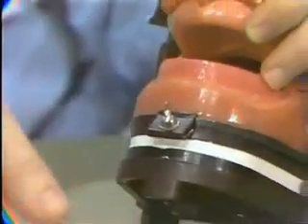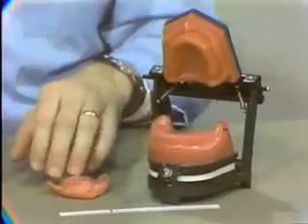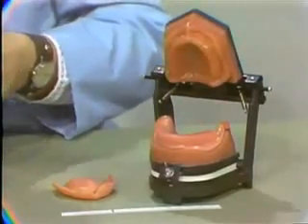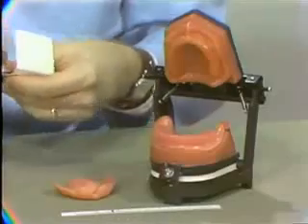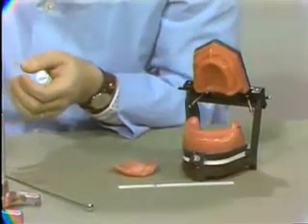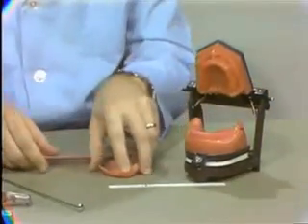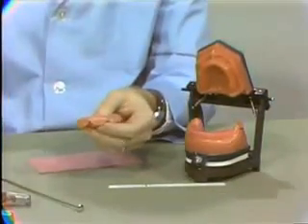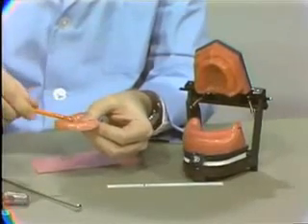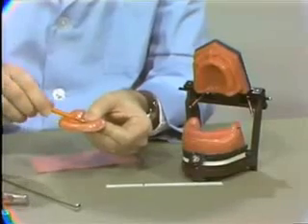Okay, let's demonstrate that now. This is exactly what you will be doing in a few moments in the laboratory. Now, as mentioned before, you can use either hot water or you can use a flame to soften the wax. I'm going to use flame. And for this size of a master cast, I suggest that all you need is about 2/3 of a sheet of wax. If you use a sheet, or some of you are using 2 sheets of wax, it is too much wax. You really don't need that much.